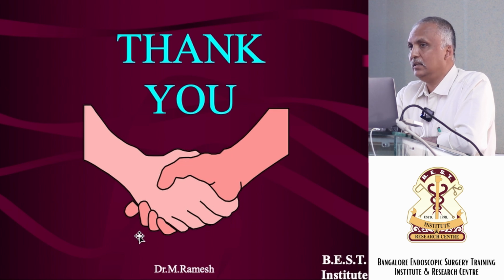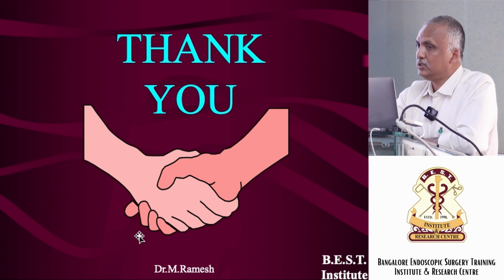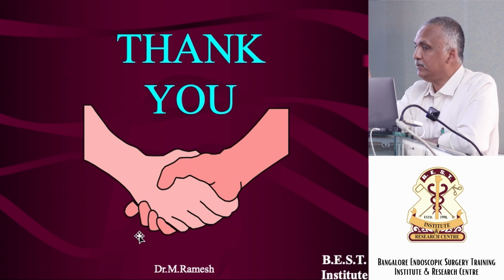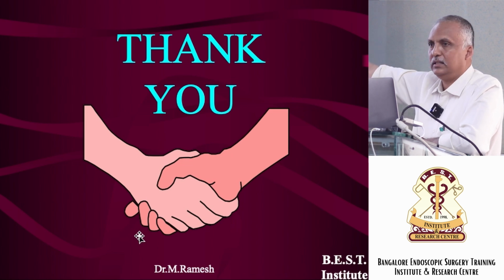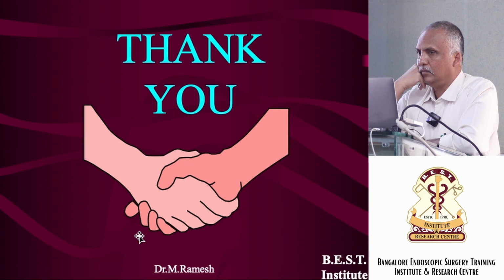So it need not be, as long as the metal is touching. So a telescope is full of metal. It's a metal tube. Even other instruments, it need not be telescope. You have another grasper in your hand that has come very close to your Maryland dissector, which is being used with diathermy. Then the metal part of the grasper, till there if something is touching it, it can cause burns. Beyond that, there is insulation, nothing will happen. So around half a centimeter to 1 centimeter.